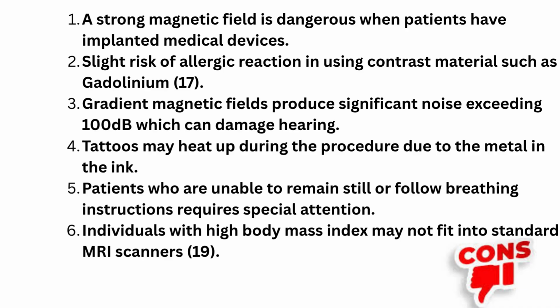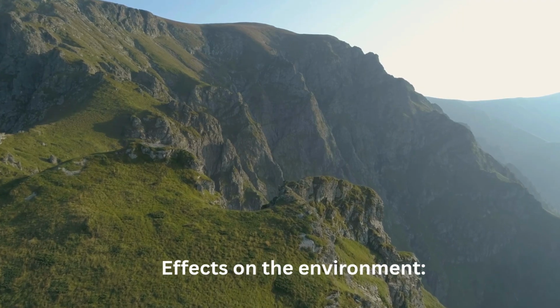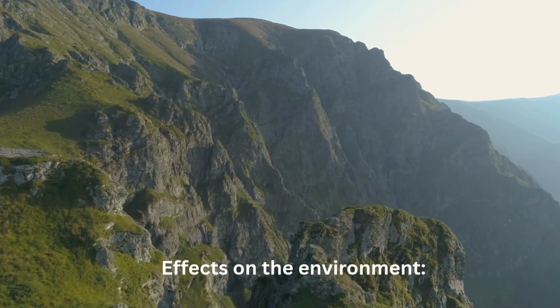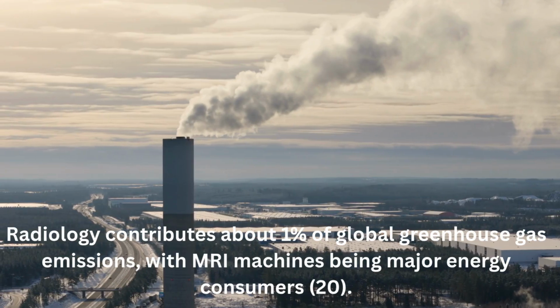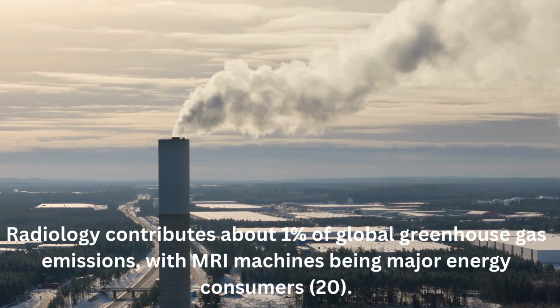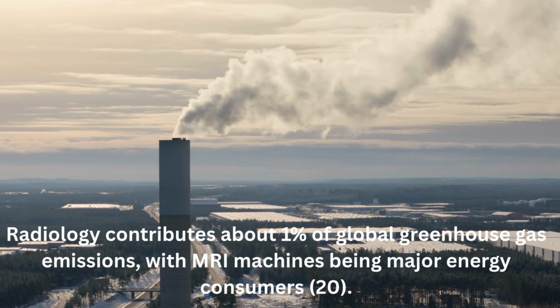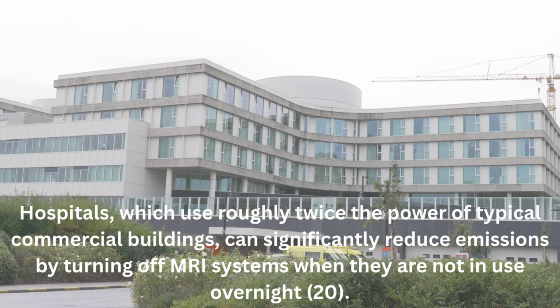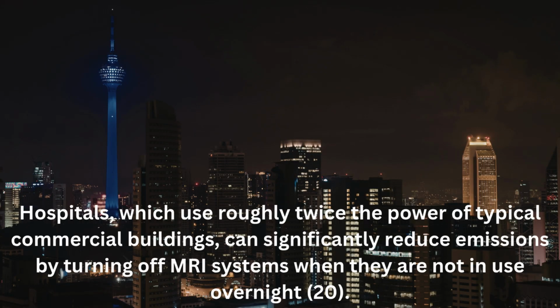Those with claustrophobia may not feel comfortable using the MRI. This can be solved by using an open MRI scanner or mild sedation where necessary. Now that we've focused on the drawbacks to the human body, we also should consider the effects MRIs have on the environment. Radiology contributes about 1% of global greenhouse gas emissions, with MRI machines being major energy consumers. Hospitals, which use roughly twice the power of typical commercial buildings, can significantly reduce emissions by turning off MRI systems when they are not in use overnight.